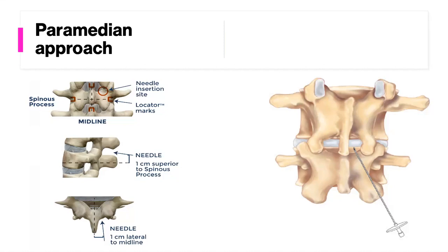Also, this approach is shown to not need the patient to have that degree of lumbar curvature in order to open up the interspinous spaces, because this is independent of them being adequately positioned. So that can be helpful when you are really struggling to position your patient in the sitting position.